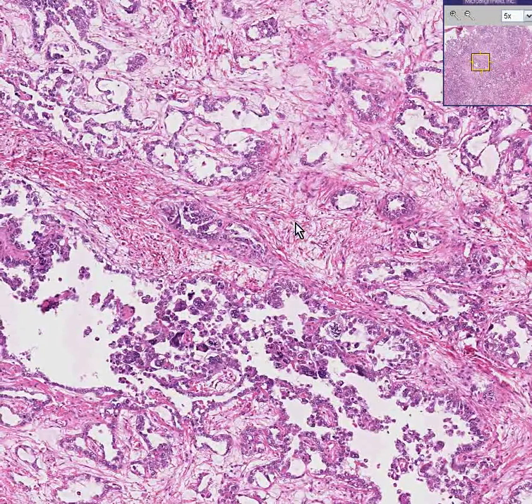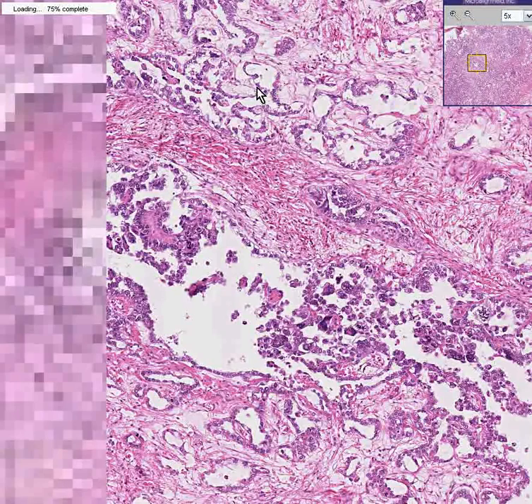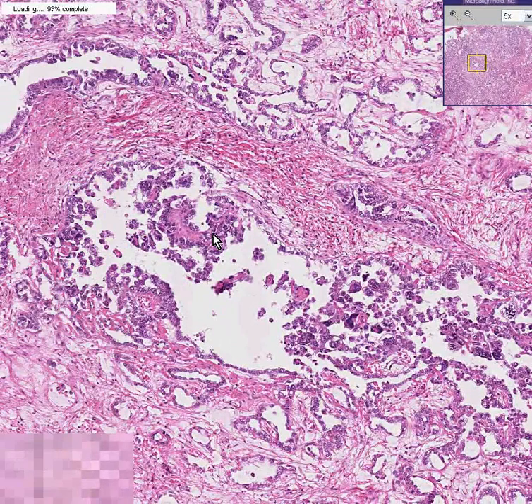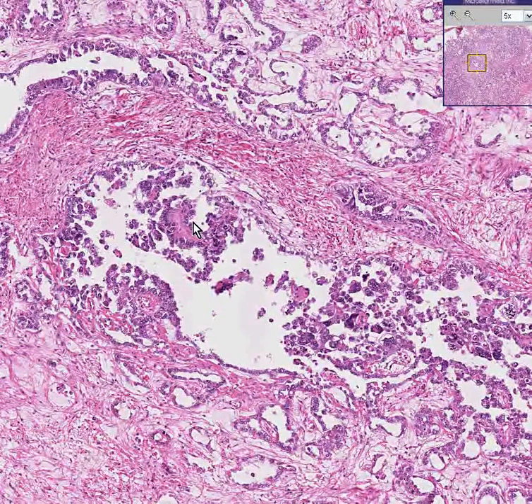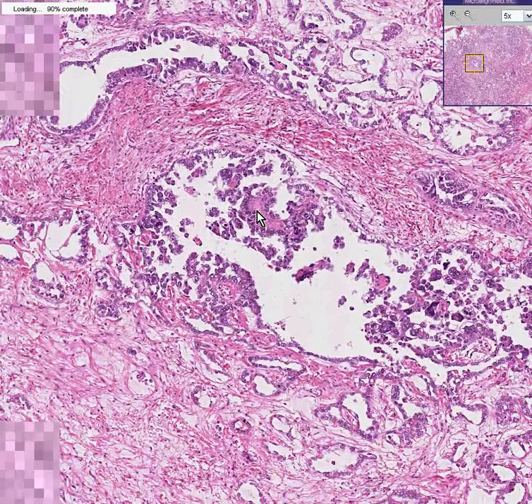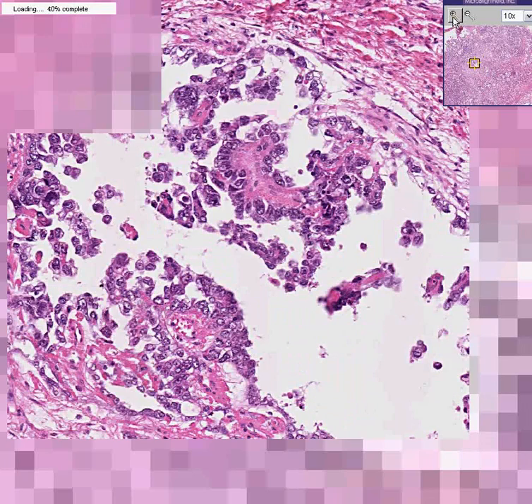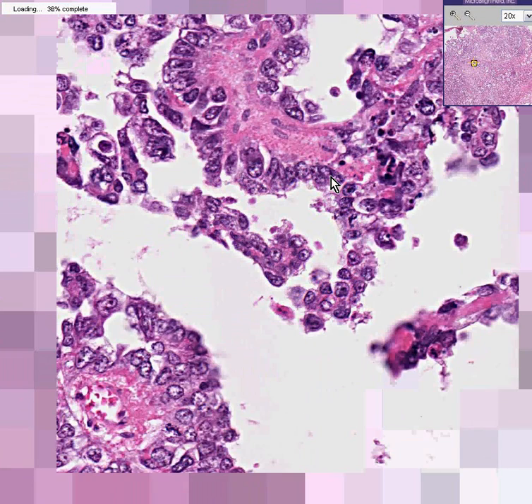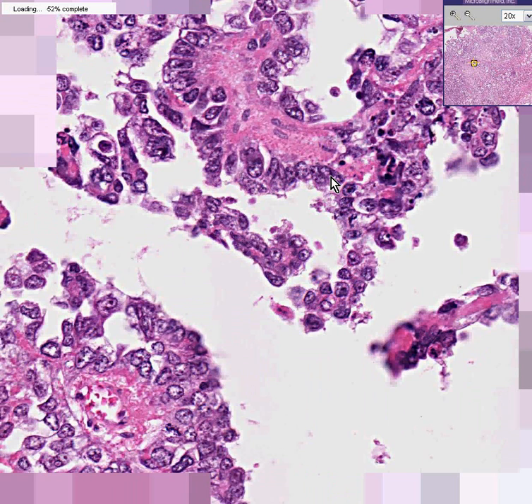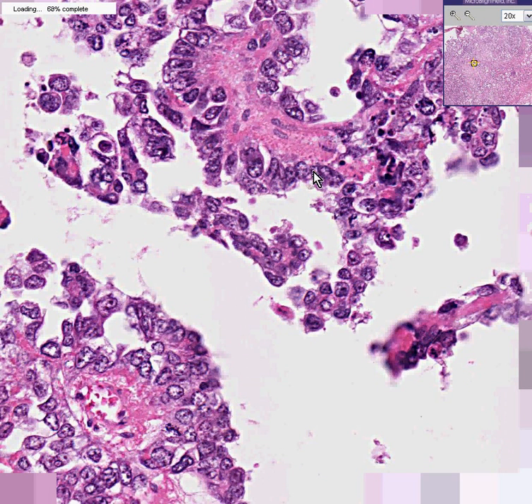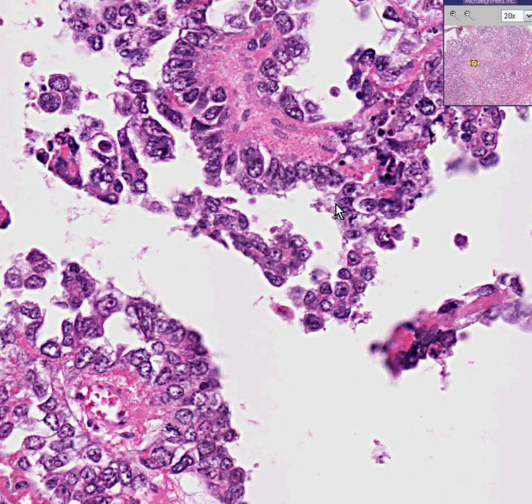And no matter where you go, you'll see things that look like either little acini or little papillary features, as well as other primitive-type cells which may not form glands. The reason I'm focusing on the glandular areas is because it is the only common germ cell tumor in which glandular-like structures are a common feature. That's what I want you to remember about embryonal carcinomas — that they almost always have many, if not even predominantly, glandular features.